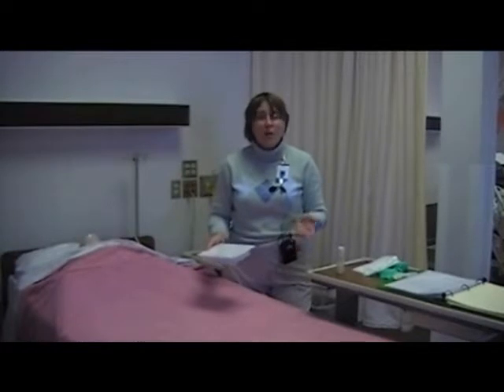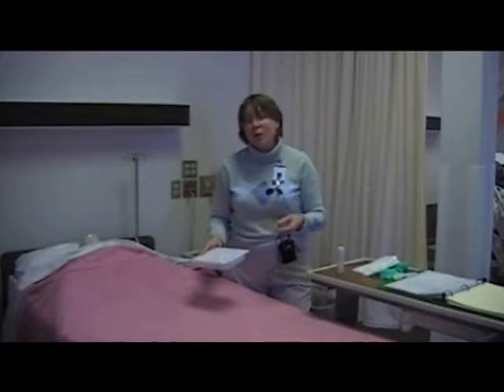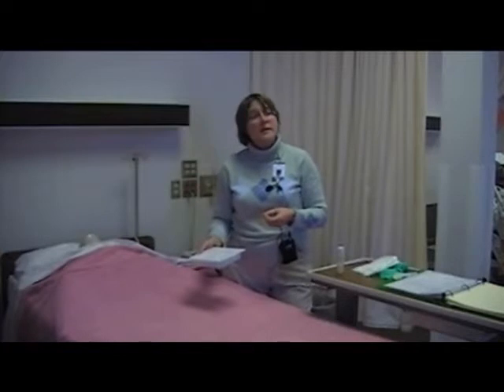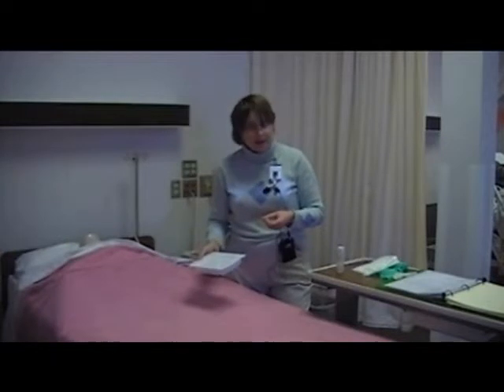Wash your hands. Wash your hands, and what have you even done before that, so that you know what you're going to do and how you're doing it? Check orders. Check your orders, and what else? Identify patient. Identify patients good also. How about what's going to be specific for your hospital? How will you know what they want you to do? Check your policy. Check your policy.